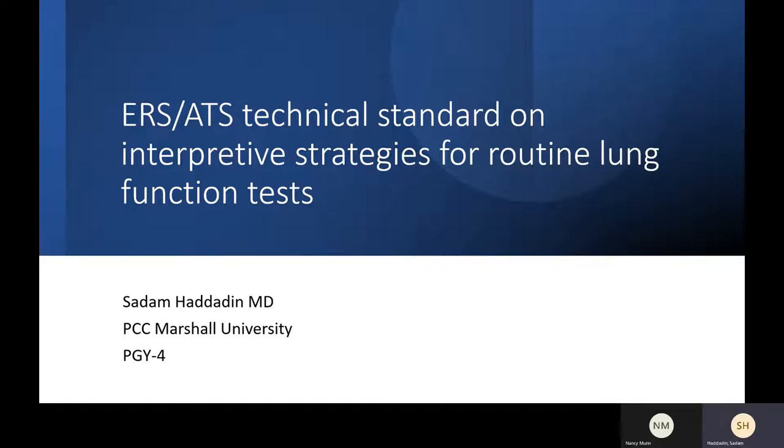Yeah, I think it defines the area under the curve where you have the majority of the patients with the same age, sex, and height. Most of the patients will fall over there. So what is the Z-score second one? Number of standard deviations. Yeah, so how many standard deviations are there? One, right? So the direction.